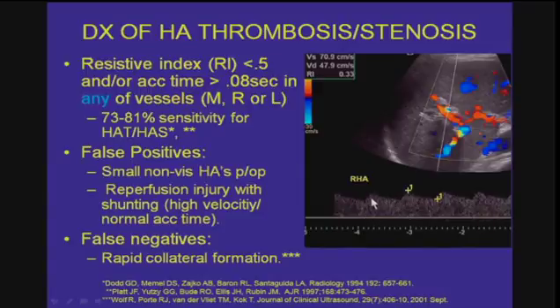And the idea is that your diastolic flow normally should be a little less than half of your systolic peak. Okay, so this is obviously abnormal. There's a lot of diastolic flow here. This is a low resistive index, and you can see here again the echogenic regions along the porta in this patient who also already has some biliary necrosis from his hepatic artery stenosis.